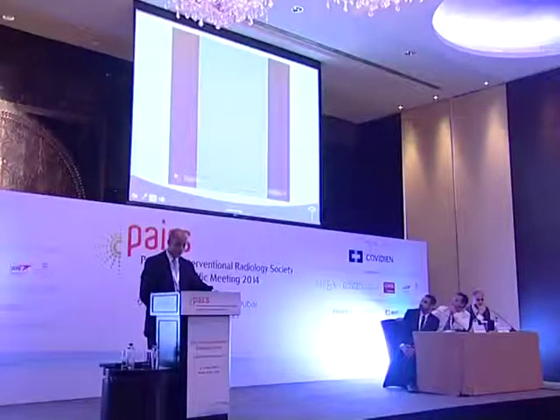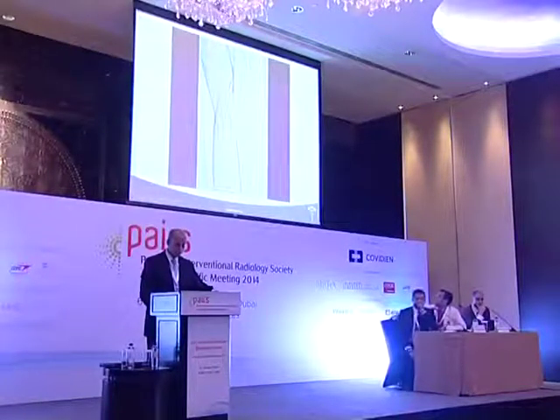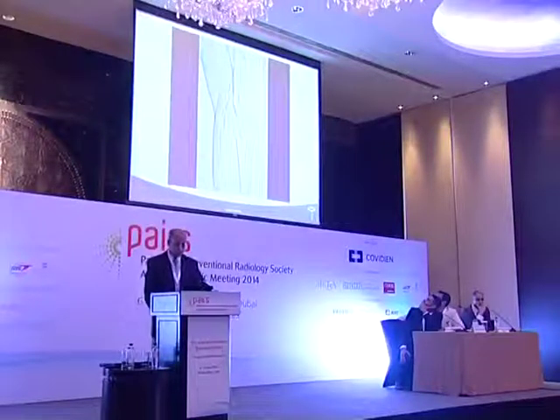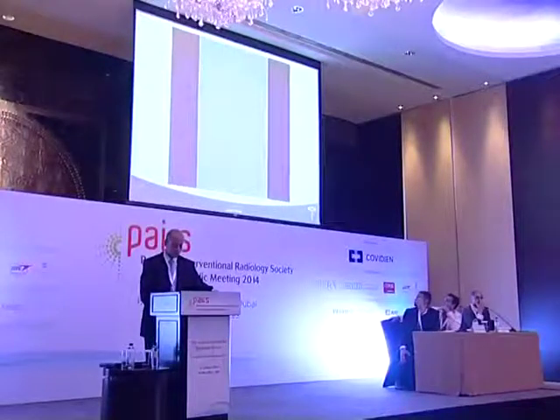Could be a covered stent with a Viabahn, okay, or, if it's really short, with the Fluency, or I don't know. Okay, so you wanted the below-the-knee anatomy. So you can see that the popliteal segment is diseased, and there is a significant disease in the TP trunk, as well as the origin of the AT and the peroneal. I'll give you more injections below the knee.